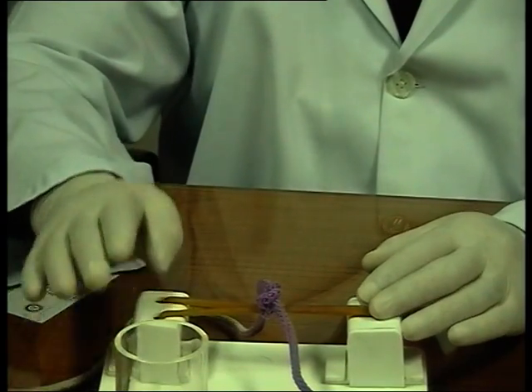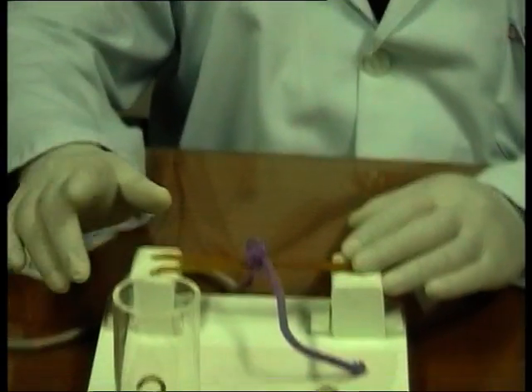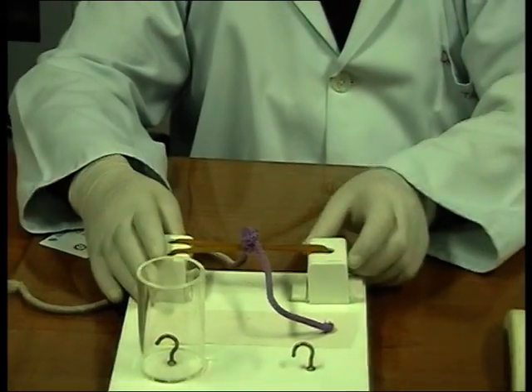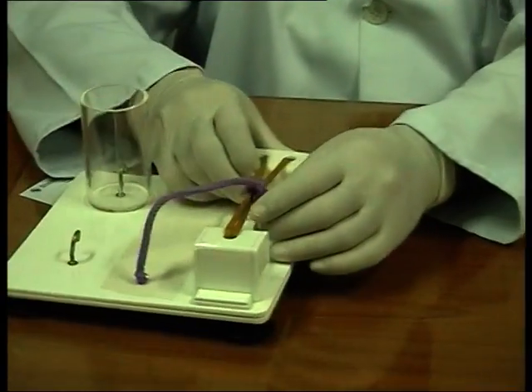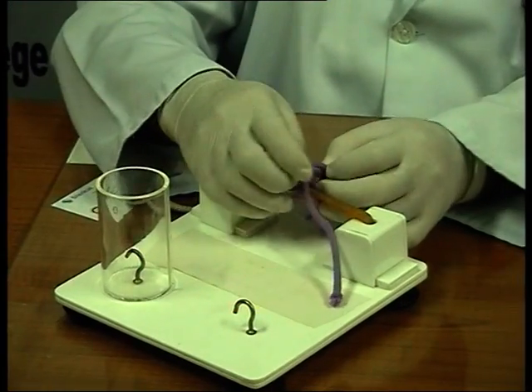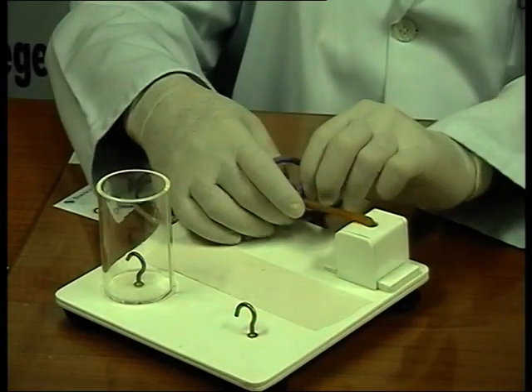I'll teach you at the end why it is important to learn with both hands. One reason I gave you was that the right hand could be injured. Or you could be dealing with a situation where the tissue is not lying like this, it could be lying like this. I'll just show you once we finish with the basic knots.